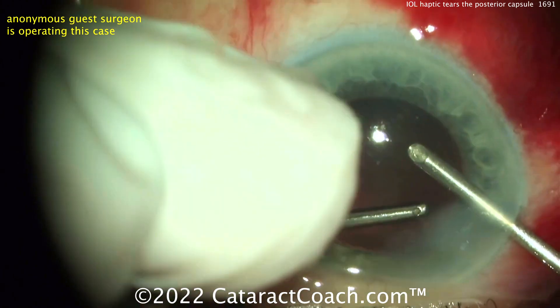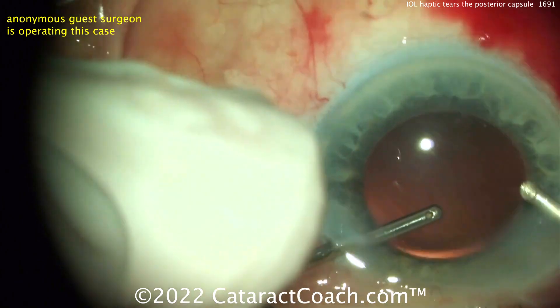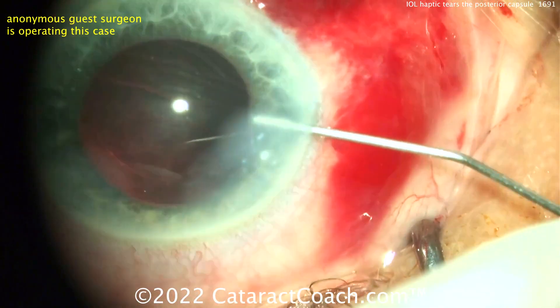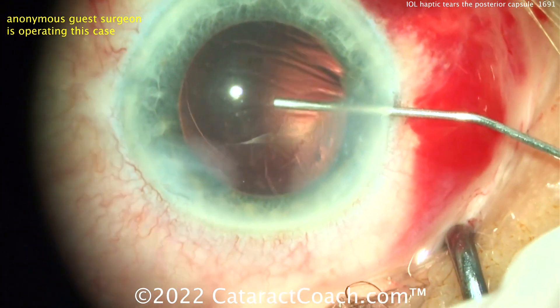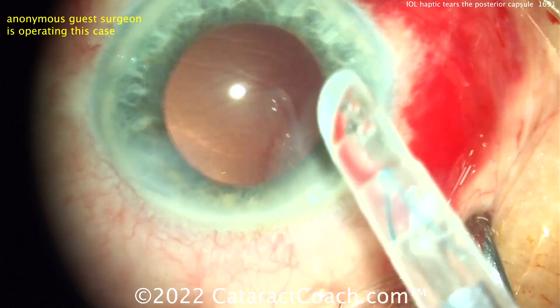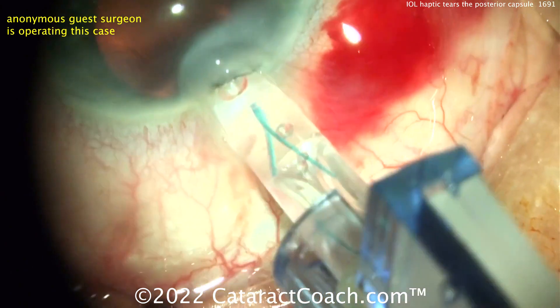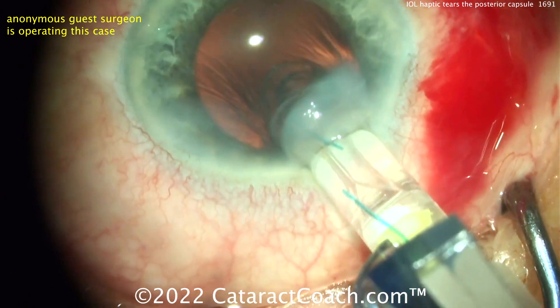For a normal human eye, the anterior lens capsule is around 14 microns thin — that's two red blood cell diameters. The posterior capsule is about 4 microns thin in the center — that's half of a red cell diameter. Remember, red cell diameter is about 7.5 microns. Watch carefully as the lens goes in.